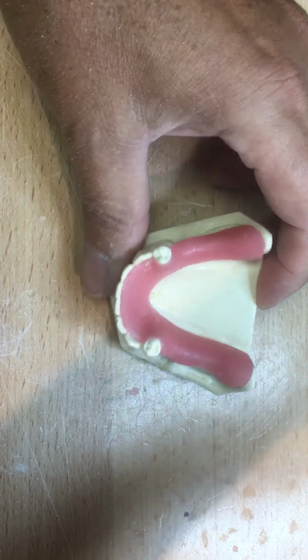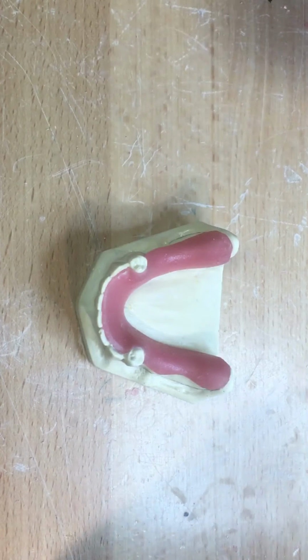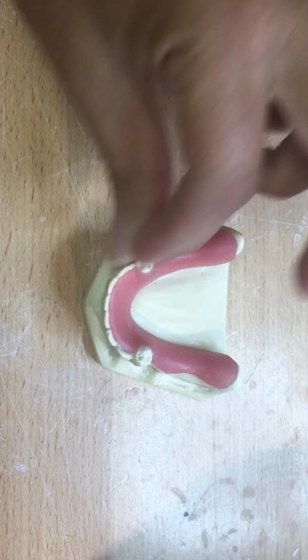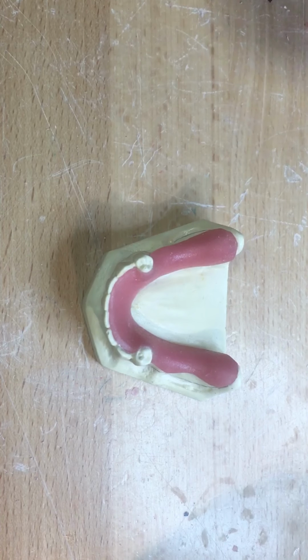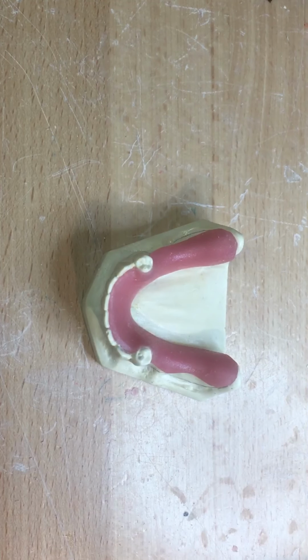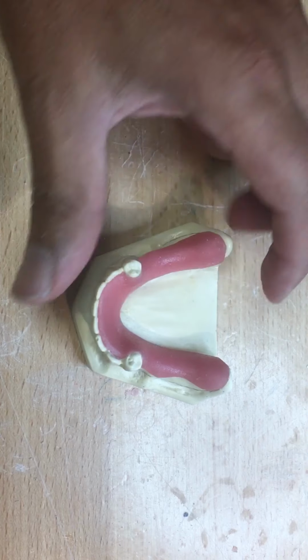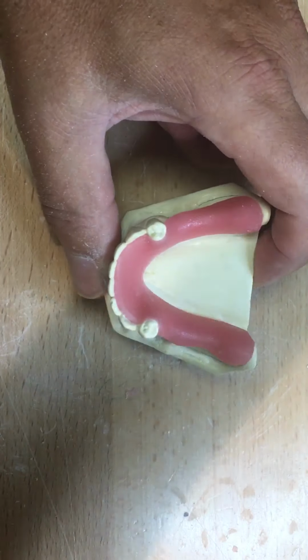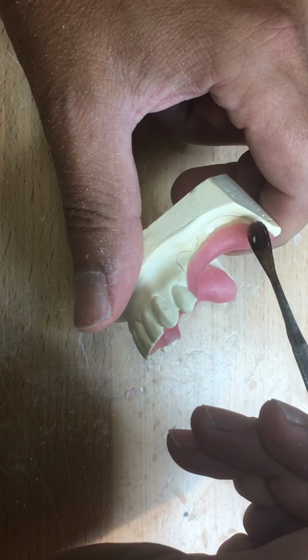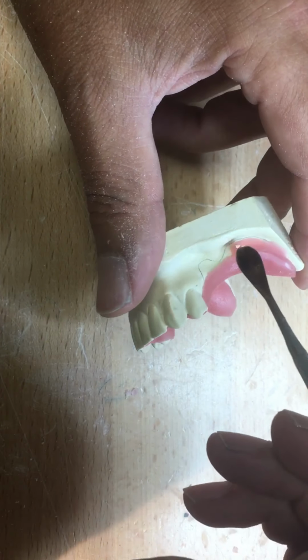Although I find if I create this too thick, then the psychology of the patient during the treatment plan is like, well, my old denture's not that thick. Even though you'll explain to them that, hey, this is a diagnostic tool to establish these 8 things we talked about, they don't care. They just say, well, my tongue interferes with this, and then they're going to talk like a lisp. And then if they have this negative feeling, let's just hope they show up for the next appointment.